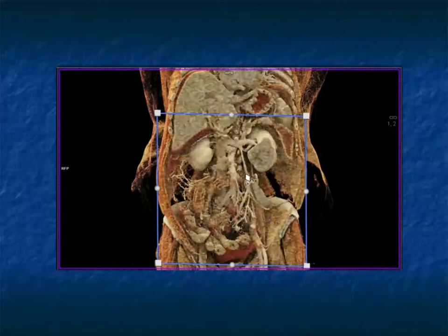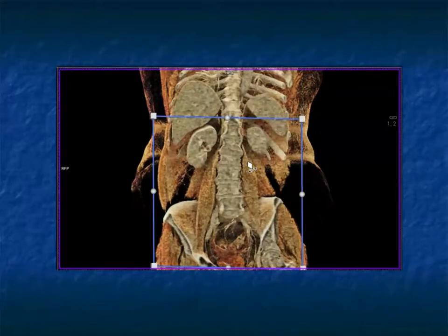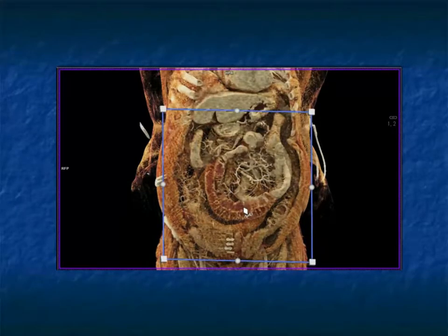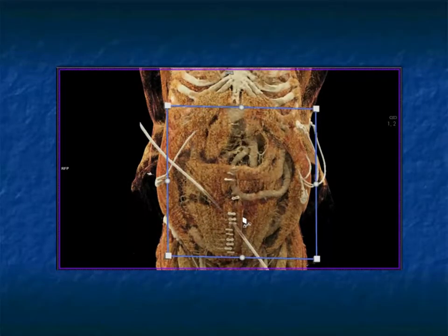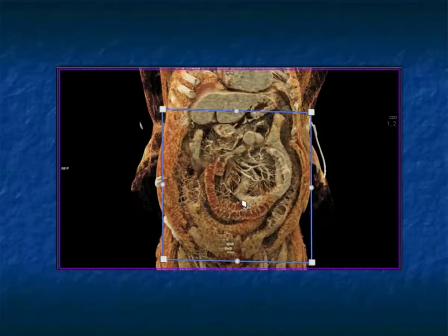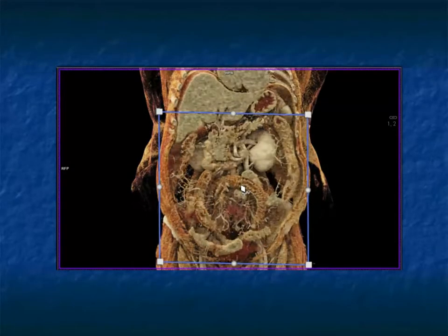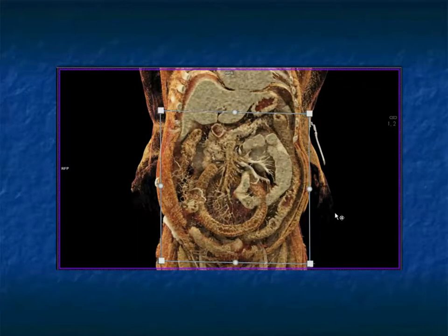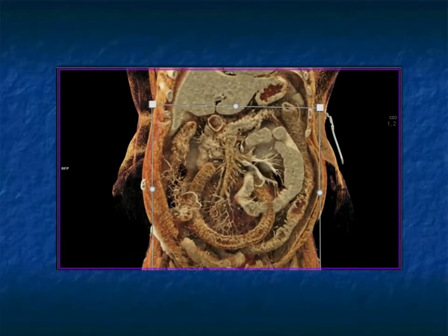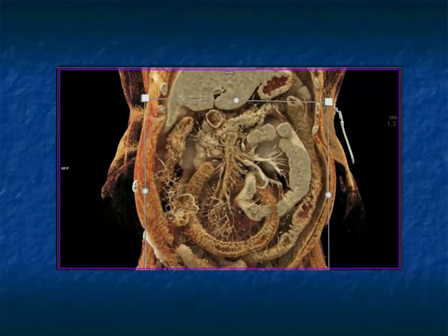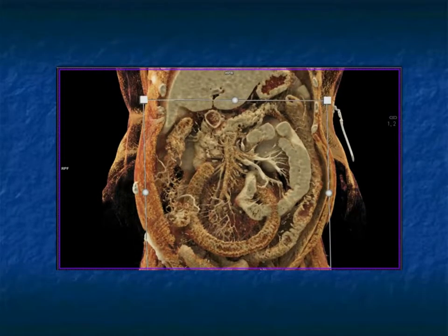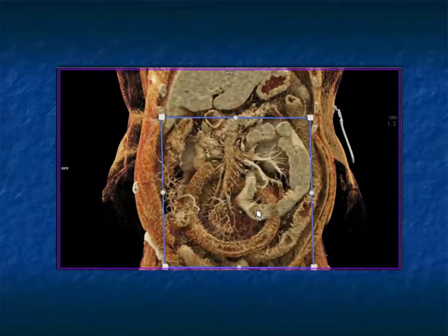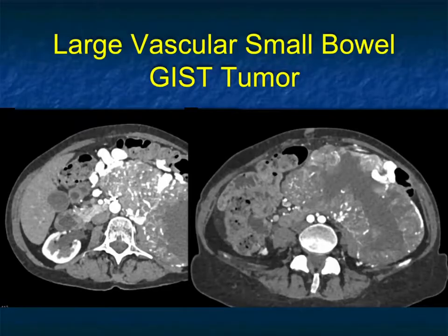Here's another rendering interactively of the same patient. Think about this as you go back and try to look at cinematic rendering in your practice. You can see staples in the abdominal wall. Cinematic rendering is good from the abdominal wall, from the skin to the subcutaneous fat, deep into the organs, deep into the vessels — it's simply using the cut planes and changing the rendering parameters that will make our job easiest.